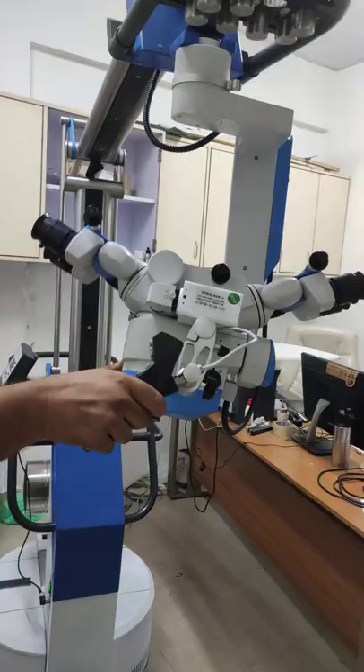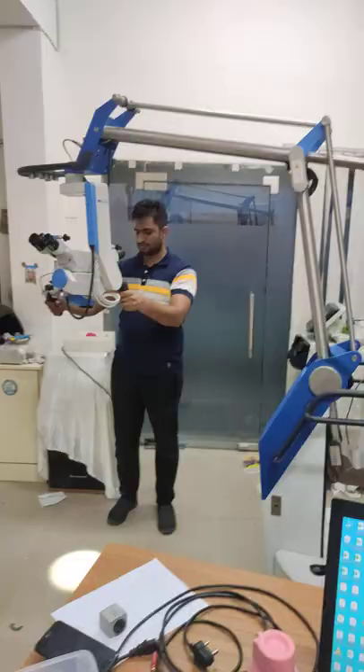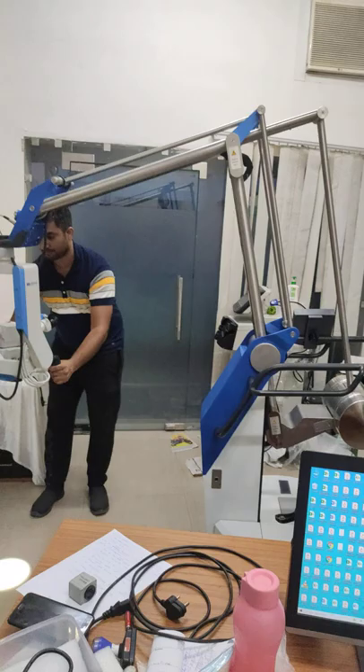Look at the smoothness and flexibility of the stand. Look at the up and down movement with this stand — very smoothly going on.